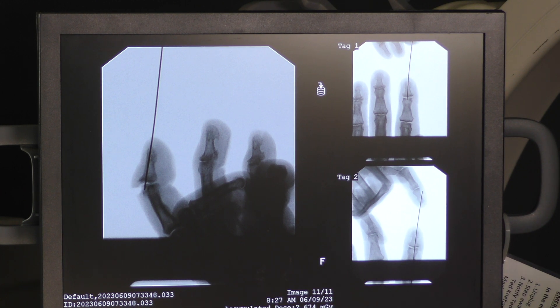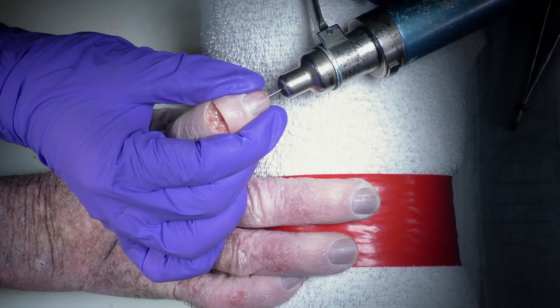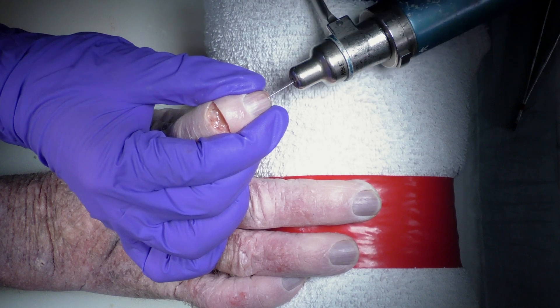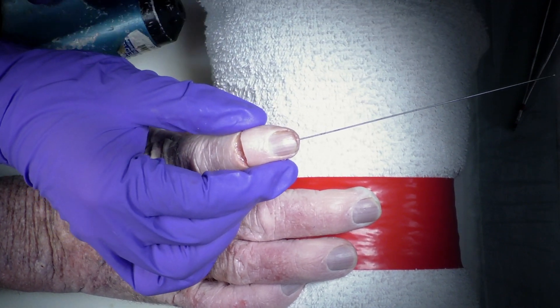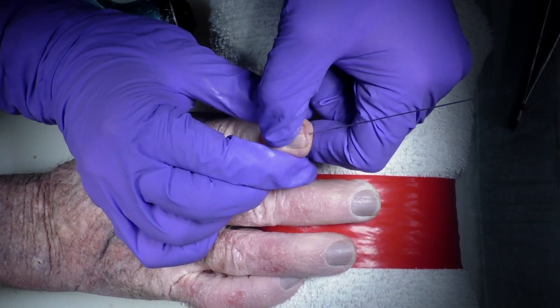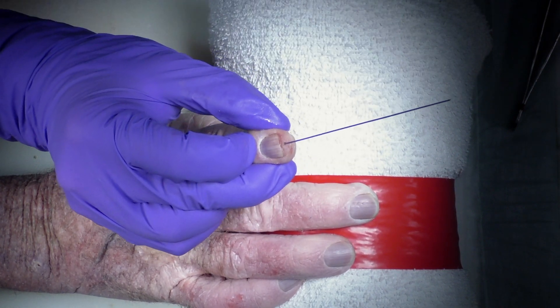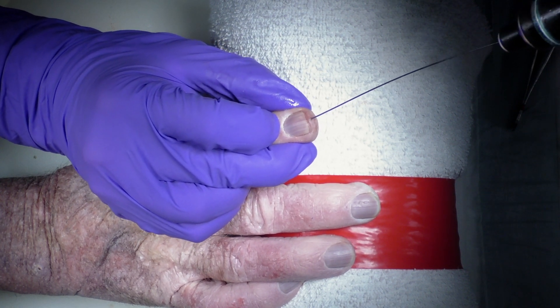Once we like the alignment of the guide pin in the distal phalanx as confirmed under the AP and lateral on fluoroscopy, we're going to want to position the guide pin so it's just barely coming out of the base of the distal phalanx. That way we can get our joint reduced how we like it — nice and straight — and then we can advance the guide pin across the DIP joint into the middle phalanx.